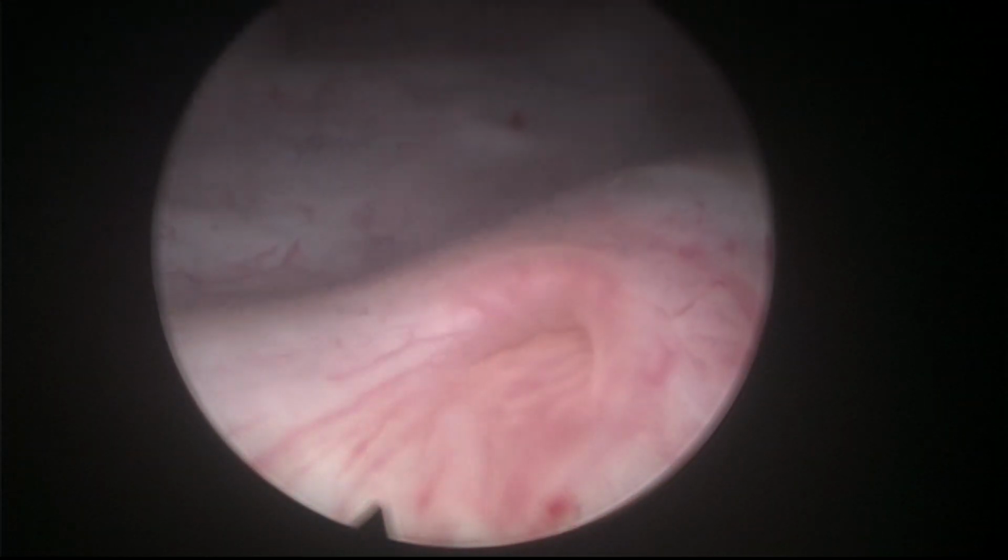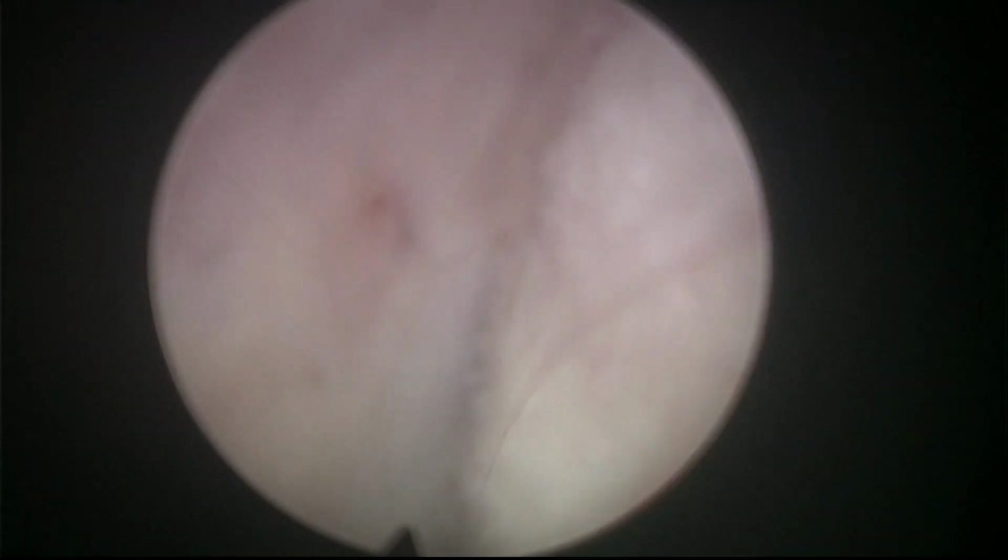So while I was waiting, I was just checking things out. There's just a little attachment on that side, on the bladder neck. That's the UO. And that's the cavity, verumontanum. And you can see the excellent preservation of the sphincter, which is what we try to achieve.